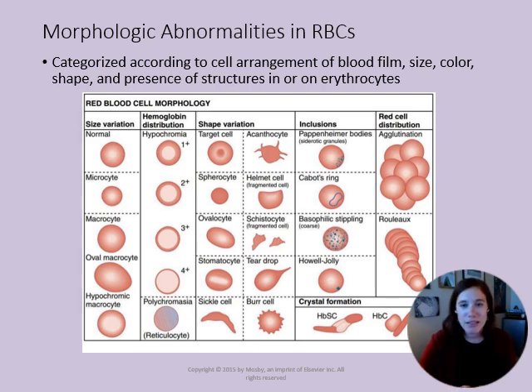Okay, we've had so much fun with white blood cells. Now we are going to move into red blood cell morphology. We'll cover a lot of this. I really highly suggest that you put many, if not all, pictures and that sort of thing for your morphology. Not only will you need this for this class, but you're going to get out in the field and you're going to be doing blood smears and needing to be looking at morphology and all that. So let's get started on some red blood cells.